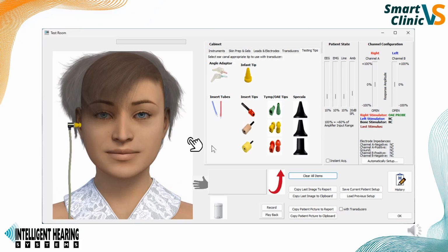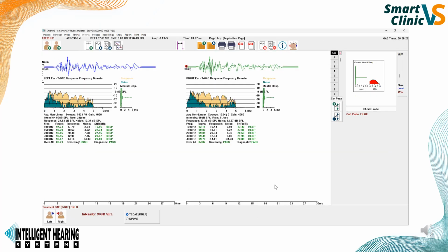Once the test has been completed, double-click on the probe to release it from the ear, and using your mouse, pull it across to the right ear and insert. After a few sweeps, you can see that the response will appear. Again, the yellow is the emission and the teal is the noise floor. You can review the response in the table below.